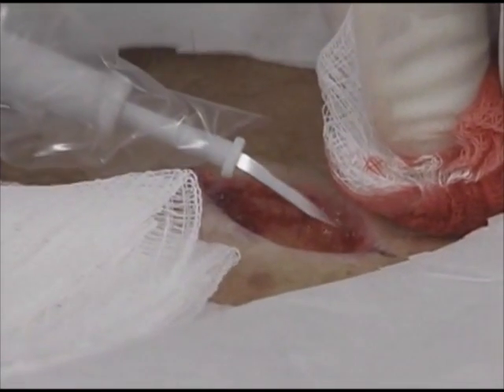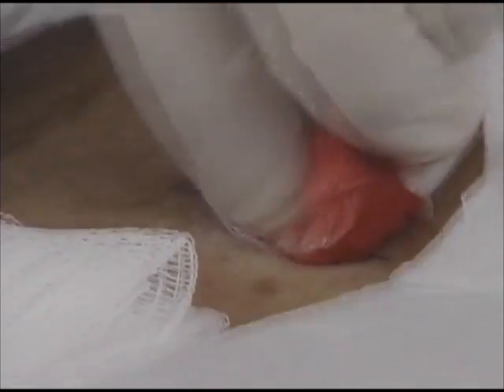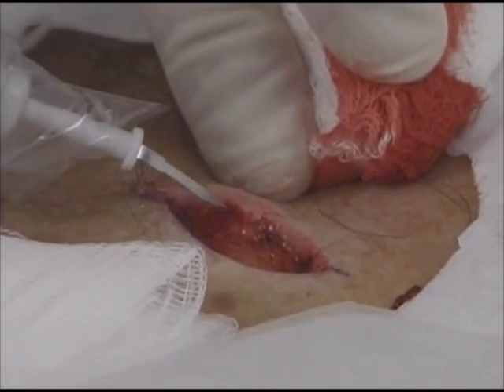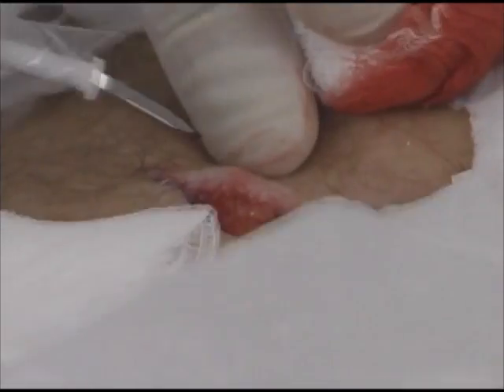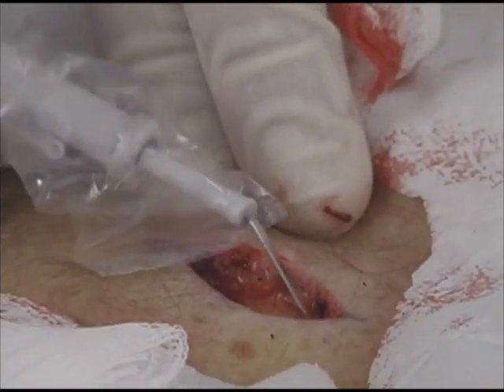The hyfercator is used to stop the bleeding before the skin is repaired. Pressure with gauze may dry the field so that electrocoagulation is more successful. Bleeding vessels can be touched directly with the electrode. In this case, the handle is covered with a sterile sheath so that the operator may continue to use sterile gloves to sew up the lesion. Sometimes electrocoagulation needs to be repeated after undermining the skin. The ultimate goal is to have a dry field prior to repairing the defect. This may prevent a hematoma, infection, or dehiscence of the wound. The final pathologic diagnosis was a melanoma in situ.